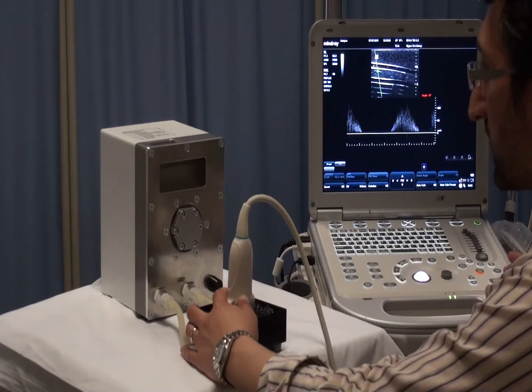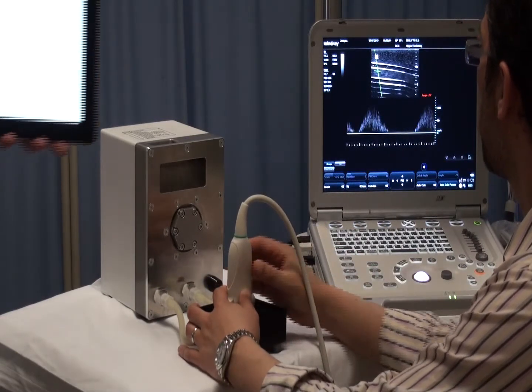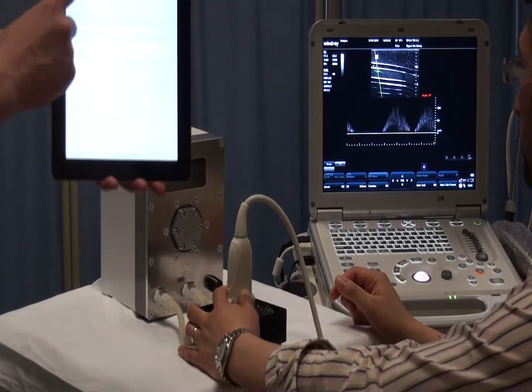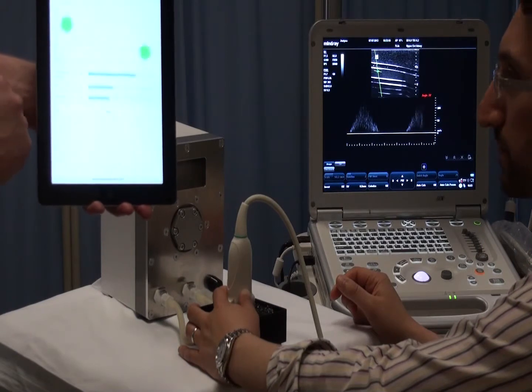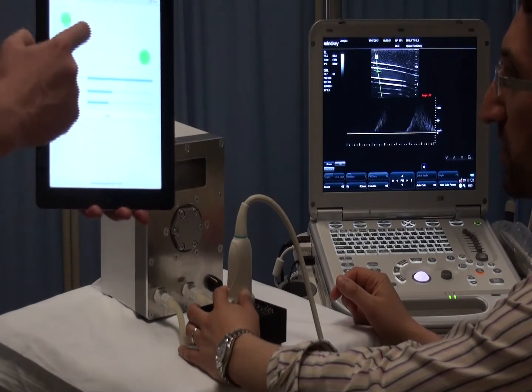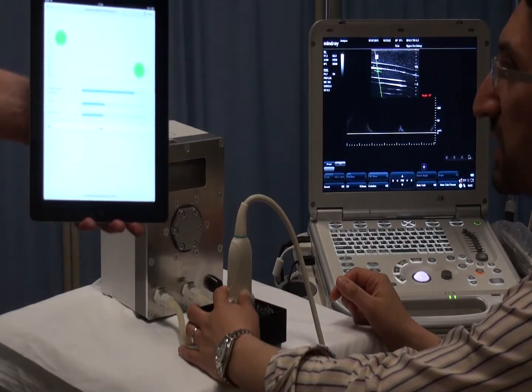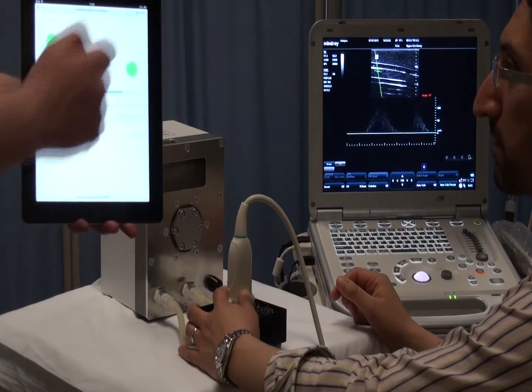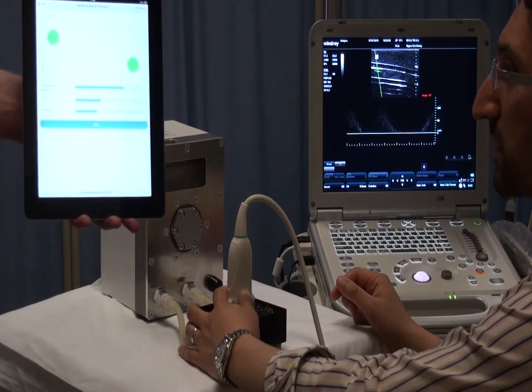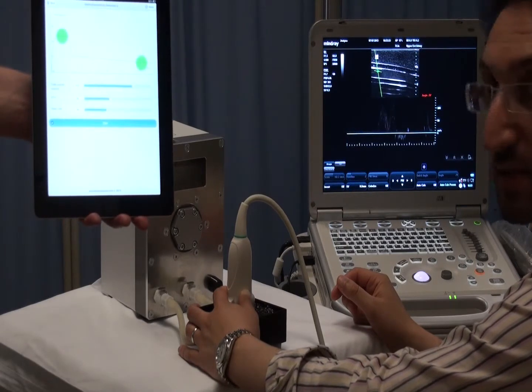Okay, let's have a look at the internal carotid waveform. You can adjust the peak and the end diastolic velocities, but let's see the preset waveform that's programmed in there. And Nikolai's hitting the reset button and sending that waveform. The simulator resets itself.